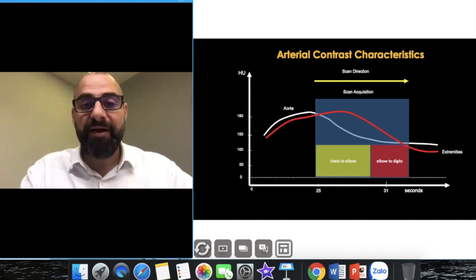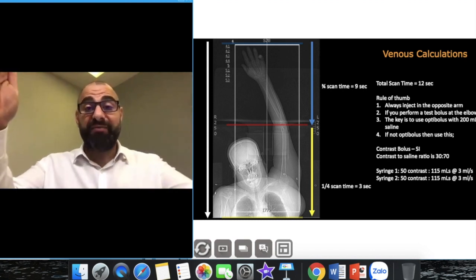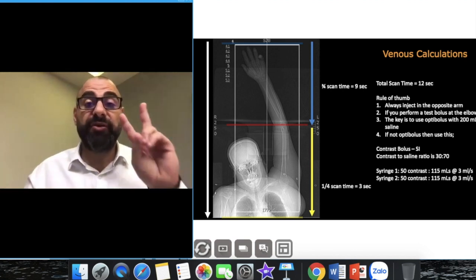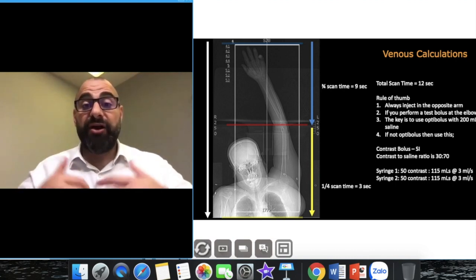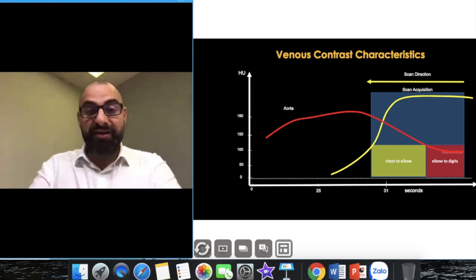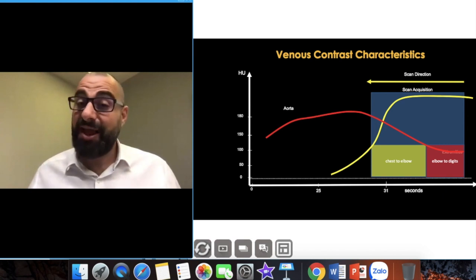For venograms I also monitor at the elbow. I wait for the contrast to come back, monitor the region of interest, and then scan. For bilateral arm venograms, I use two syringes — in each syringe 30 mils of contrast and 70 mils of saline — and inject both at the same time. For bilateral venograms or SVC studies, if you don't have a double barrel injector you'll have to do indirect venography. I do my ROI at the elbow and watch the peripheral vessels around it; once they start to fill I know it's time. I start from the fingers upward, working in the opposite direction.